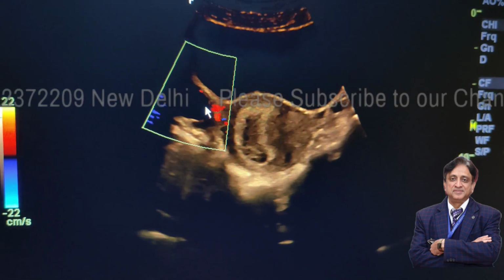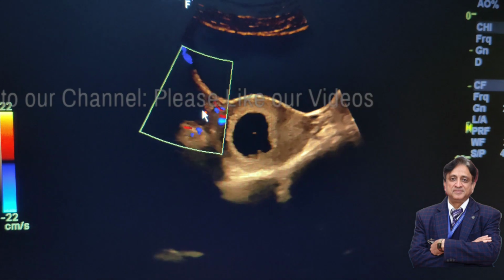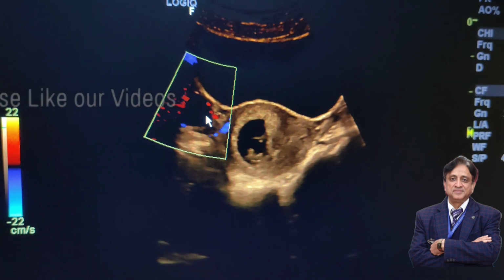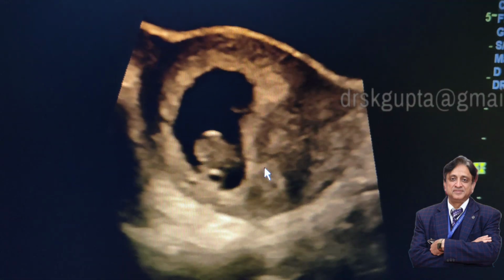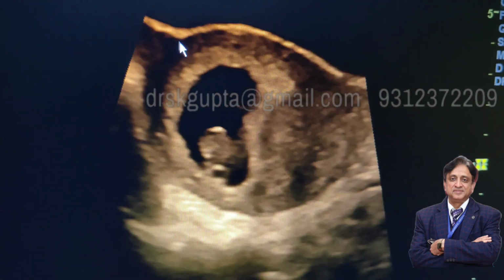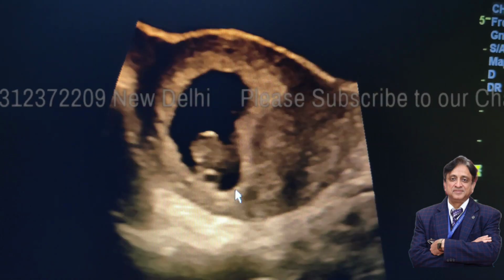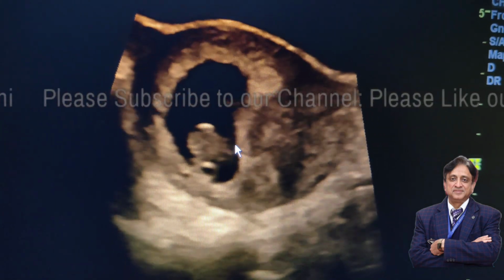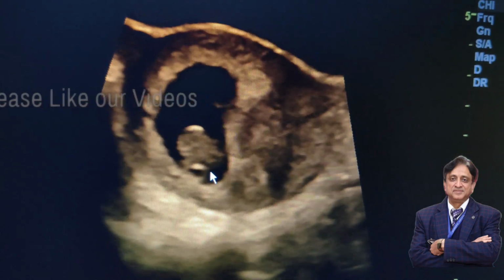Corpus luteal cyst can be present in either ovary, but it is always on one side. It is on the side from where the ovum has come out, and so this is the corpus luteal cyst. Here you can see that the chorionic reaction is good and regular, and all around the gestational sac it's just a healthy pregnancy, and the sac is regular in shape.